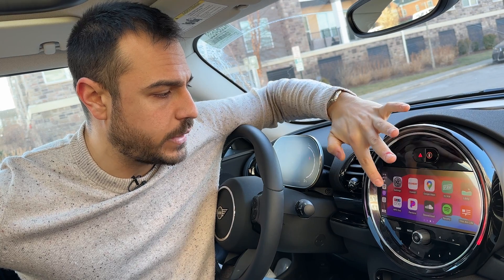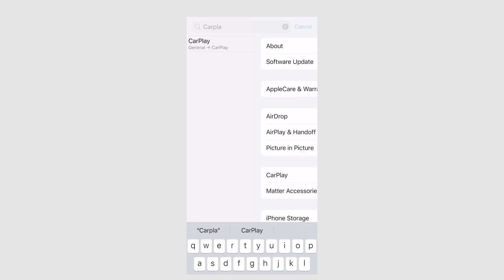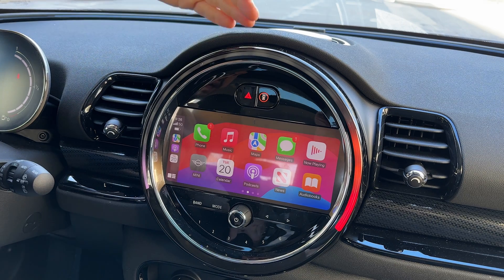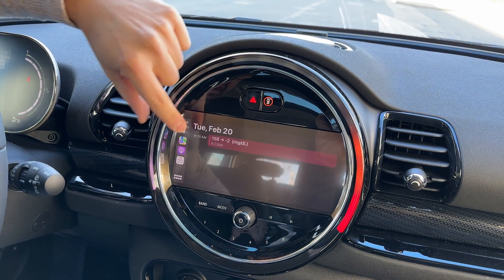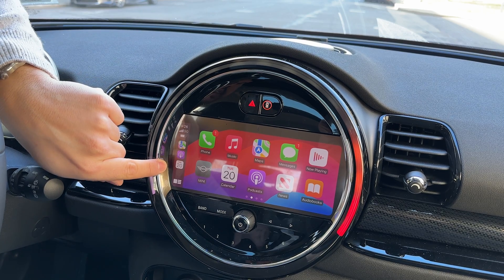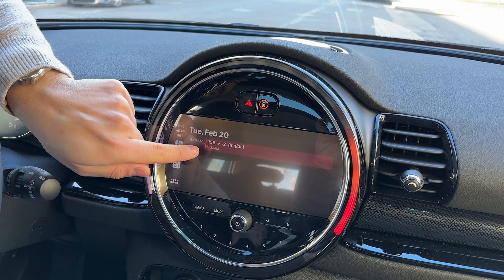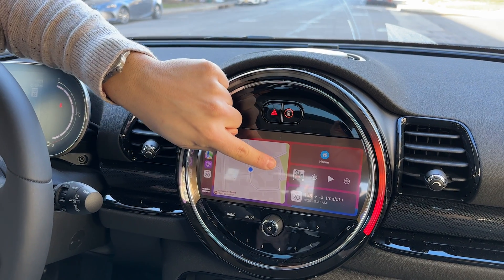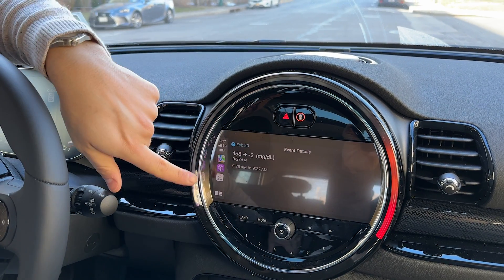Now that you've got that all set up, you have access to your glucose readings on iCal on your dashboard. There are a couple of ways you can access it. I have a bunch of apps on the screen — one of those is iCal. Make sure that iCal is set up as an app on your CarPlay through Settings on your iPhone. Once that's done, you'll have that iCal icon in your apps. Tap on it and you can see your glucose readings right there as an event for the next five minutes. It's also located on the side of the screen as one of your most recently used apps. You can also see it on the CarPlay home screen by swiping all the way left — where you'll see the map, music, or podcast — and the iCal icon in the corner showing your glucose levels. Tap it for full screen.